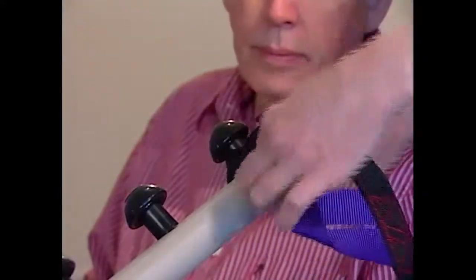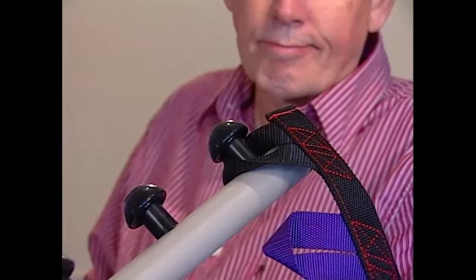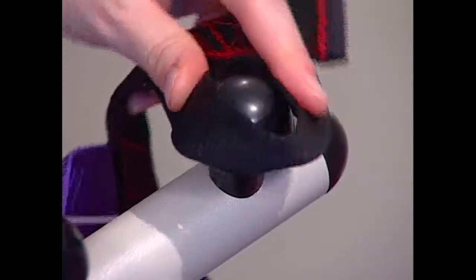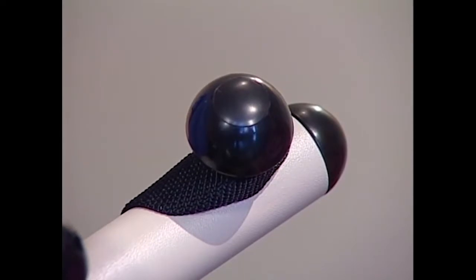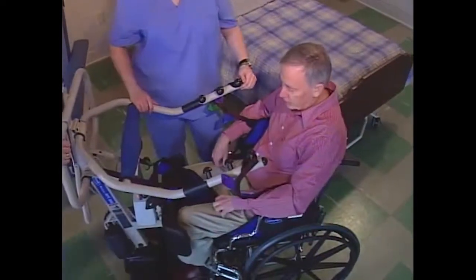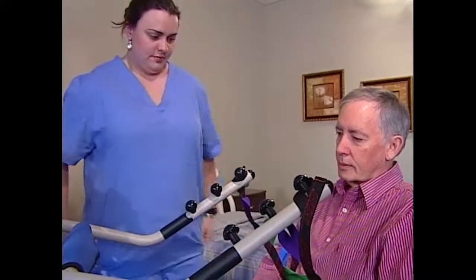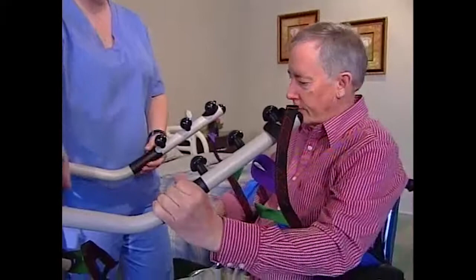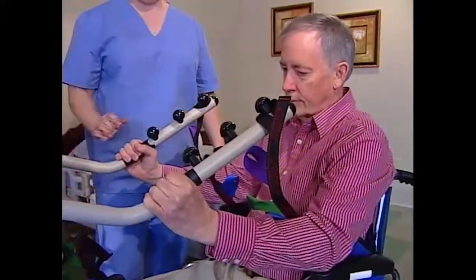Attach the strap around the lift arm from the outside. Make sure all loops rest flush against the attachment spindles and are clear of the attachment knobs. The resident's arms should be outside the sling. Instruct the resident to hold onto the hand grips on both sides of the lift and lean back into the sling.